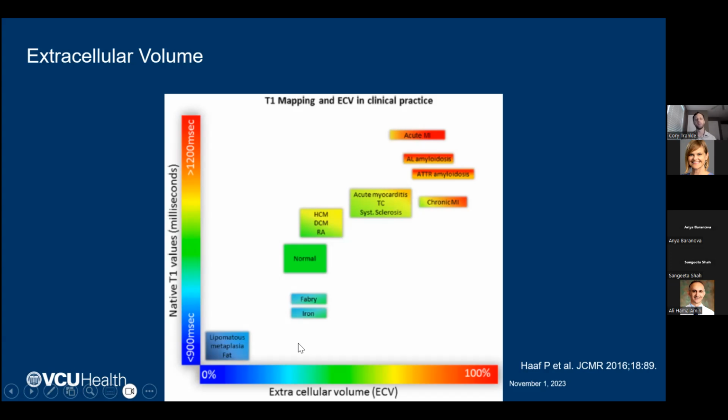And I used to wonder, if they follow an X equals Y sort of linear association, what is the value of ECV? But I think I've come to understand it as a couple things. ECV is like the INR of T1 values. T1 values can vary based on scanner, field strength, vendor, those types of things, and so it's hard to read an article that tells you certain T1 values and then bring that home and use it on your own scanner, because it might not be the same calibration, whereas ECV should be the same across institutions.